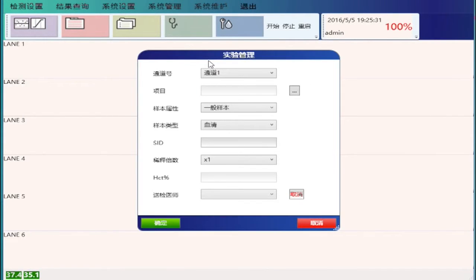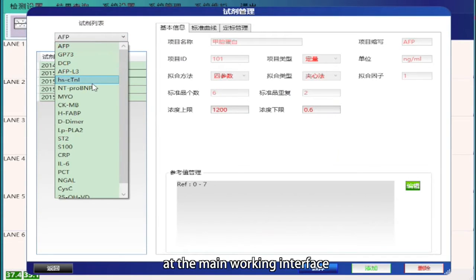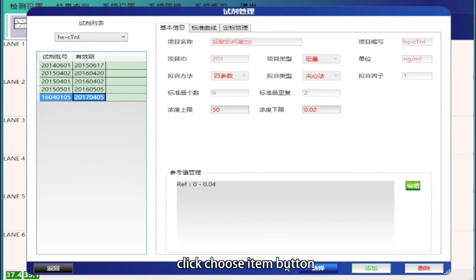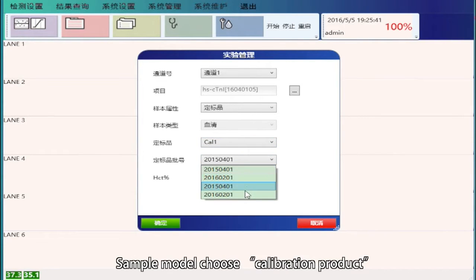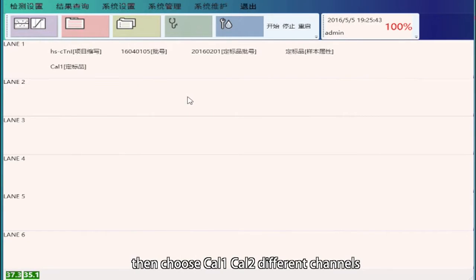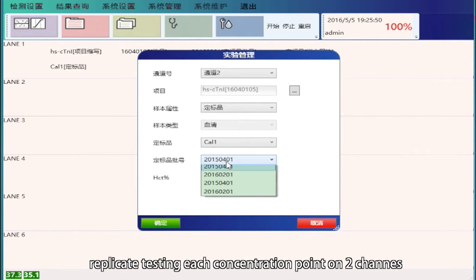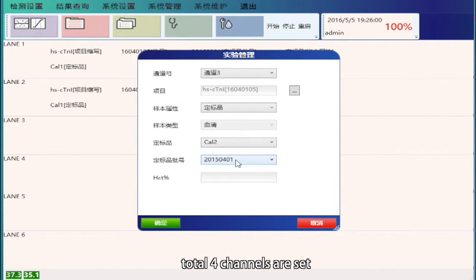Calibration: after importing the main curve, we need to calibrate the curve before testing with this batch. At the main working interface, double-click the channel. Click Choose Item button and select the item and batch number from the pull-down menu. Click Select to confirm. Set Sample Model to Calibration product, then choose Calibration 1 plus Calibration 2 on different channels. Replicate testing each concentration point on two channels — total four channels are set.